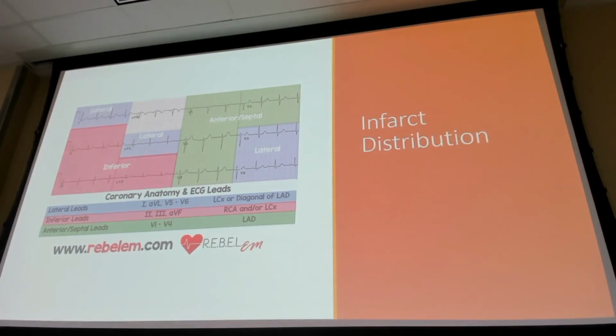It is important to remember which coronary artery is affected by these. So your inferior, we worry about the RCA. Those lateral leads could be the LAD, or it can be septal as well.